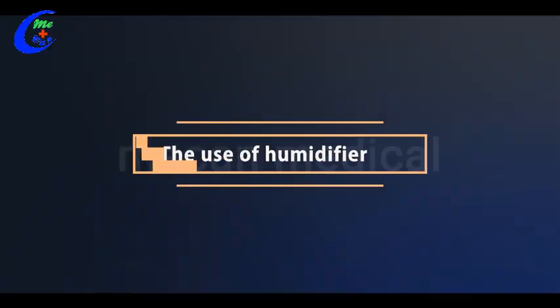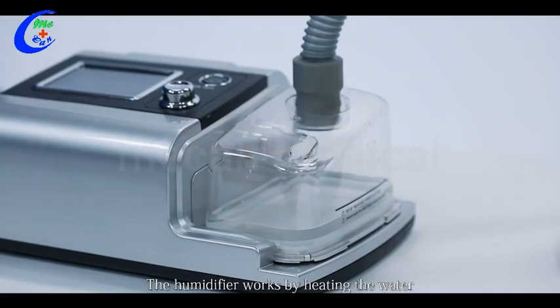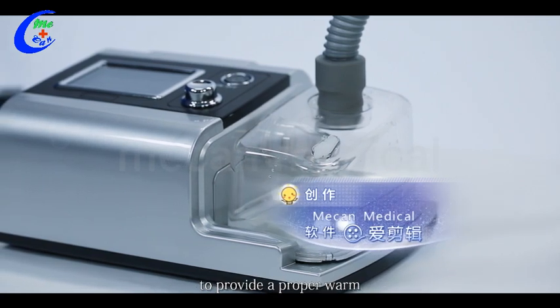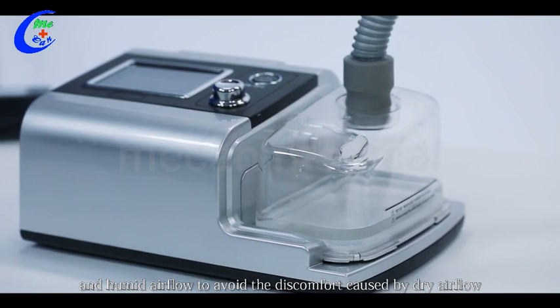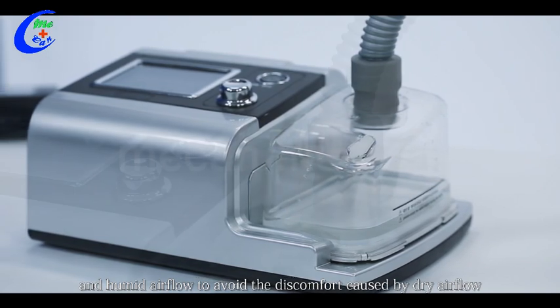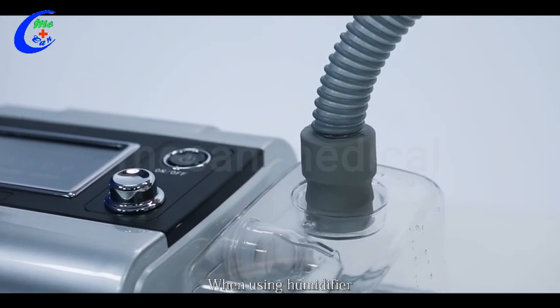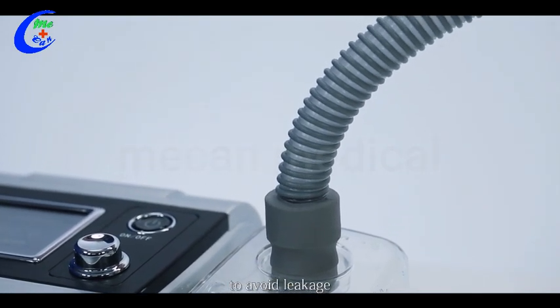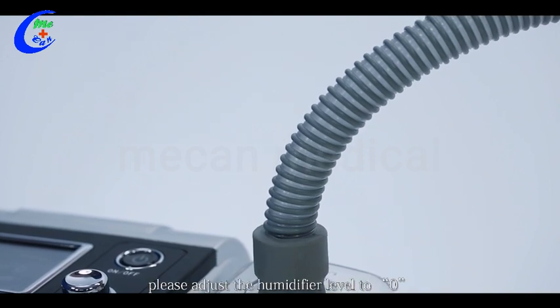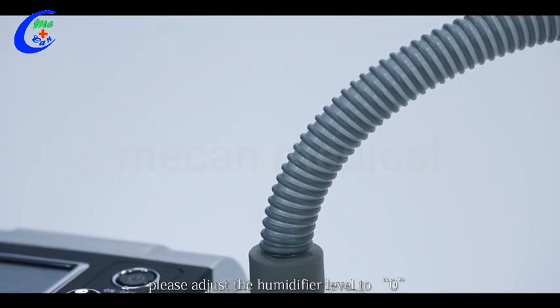Two, the use of humidifier. The humidifier works by heating the water to provide a proper warm and humid airflow to avoid the discomfort caused by dry airflow. When using the humidifier, we recommend using our original tube to avoid leakage. If you don't need the humidity function, please adjust the humidifier level to zero.